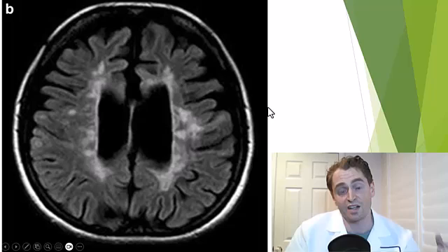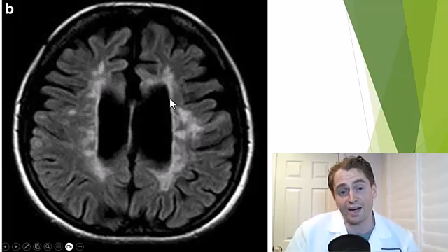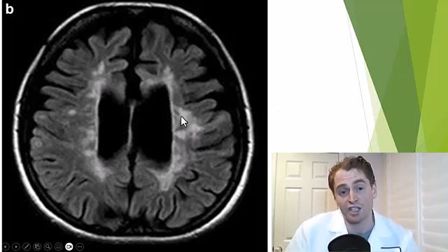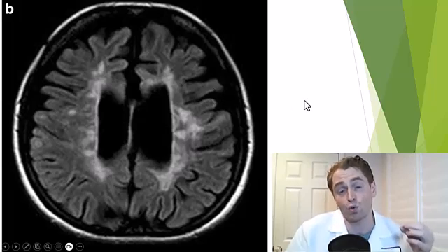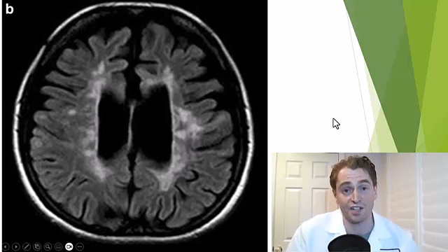Here is another example. Again, the lateral ventricles are touching these periventricular lesions, and the sulci — the gaps between the gyri — are much larger than normal, indicating brain atrophy.